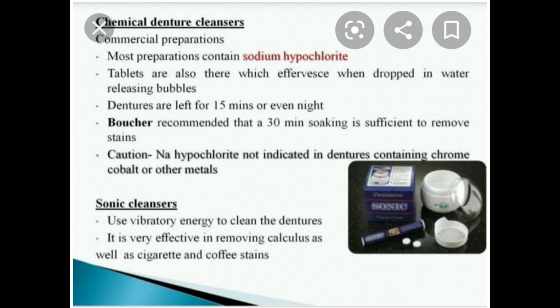So once again I repeat, we can clean manually, with chemicals like denture cleansers, and there are ultrasonic cleansers also. Manually, you should never use regular toothpaste, and the impression surface should be cleaned very gently. When denture cleansers are used, the dentures can be immersed in water containing denture cleanser for 15 minutes, or even kept overnight.